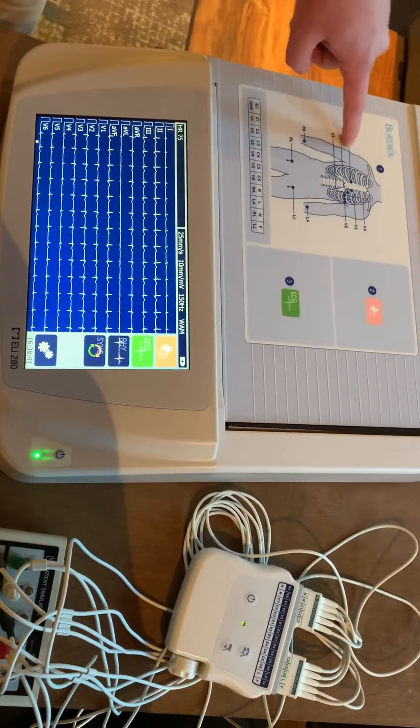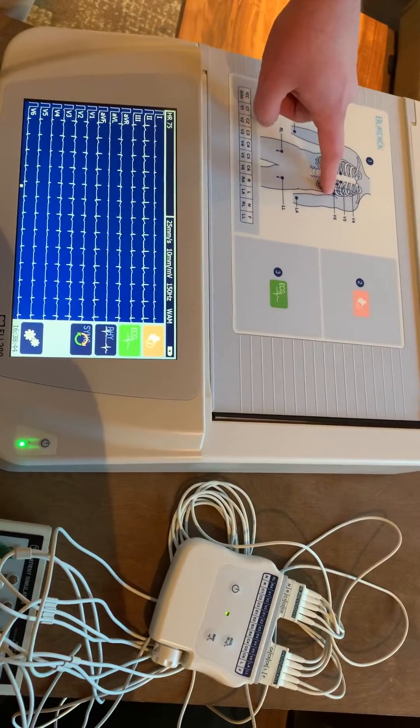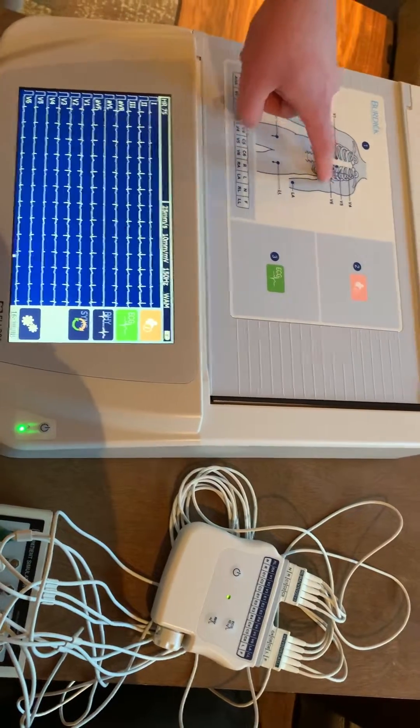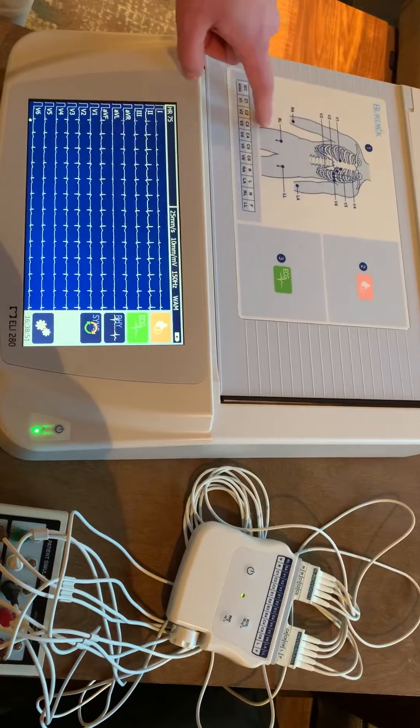The first step is to hook your patient up. Make sure all the leads are placed properly — make sure you're placing the V leads between the intercostal space, the limb leads in the appropriate location.